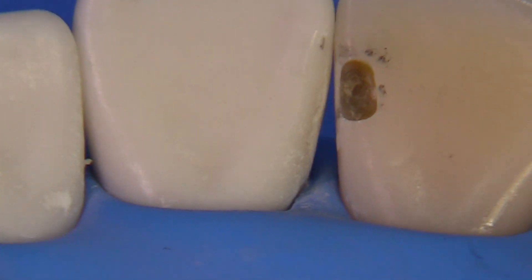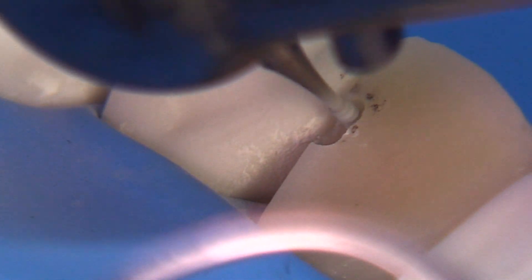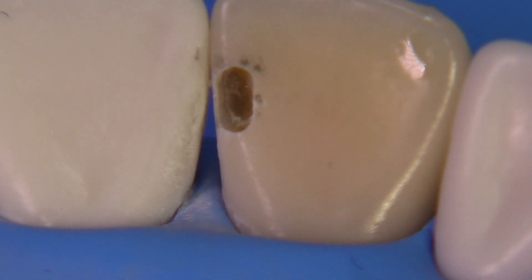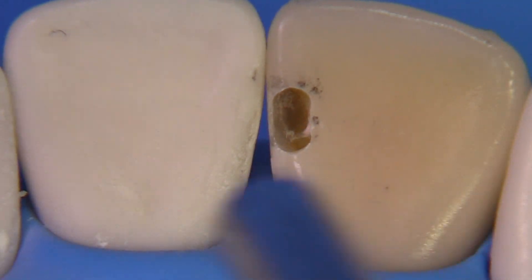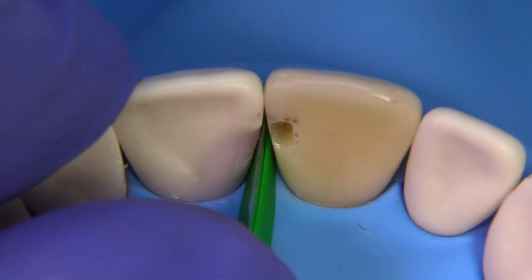Notice I'm not using the bur at full speed — take it easy here. We're trying to get about 1.2 to 1.4 mm of axial depth — in other words, as you push the bur toward the distal, that is called axial depth. Facial extension is the other dimension, and then approximately 2 to 2.5 mm incisal-gingivally, with the gingival portion breaking contact and the incisal portion not breaking contact. This is the general rule for the ideal class 3 preparation.